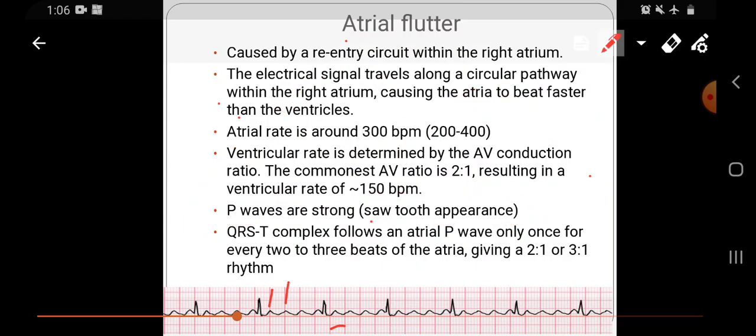طيب الventricular rate كيف بدنا نحسبه؟ بدنا ناخد الديستانس between two R waves. هلا دائما لما بتحسبوا الريت حاولوا تلاقوا ويف تكون مثلا زي هاي exactly جاية على اللاين اللي بفصل بين المربعات الكبيرة، وتاخدوا وحدة تانية بيكون كتير أسهل. هلا هون الآر في بيناتهم 1 2 3 4 مربعات كبيرة ومربع صغير واحد. اوكي، وبالتالي هون الفنتريكولار ريت رح يكون تقريبا 70 beat per minute.